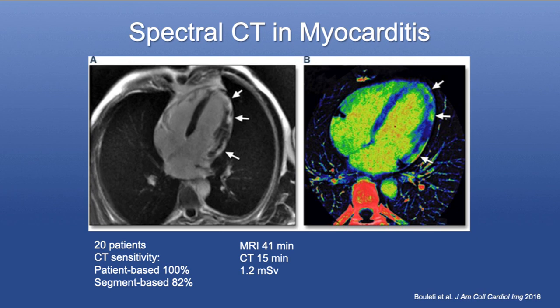I think MRI still has a lot of advantages to image these patients with myocarditis because we can image edema also. It's hard sometimes for hospital systems to have the availability to do inpatient MRIs for many of these high volume institutions.